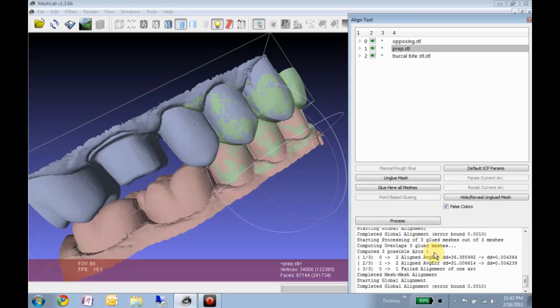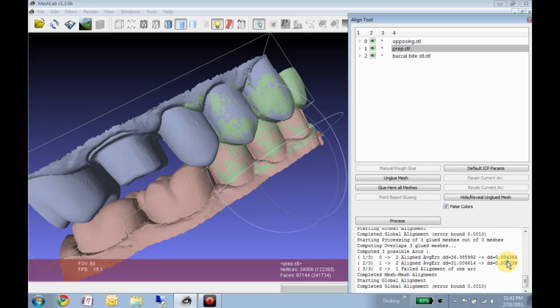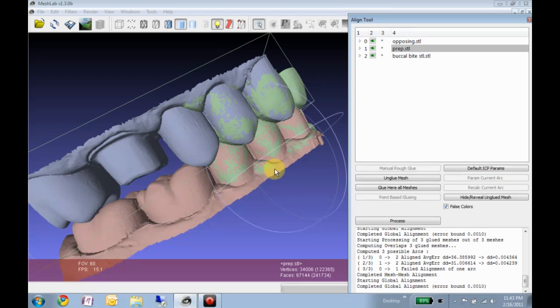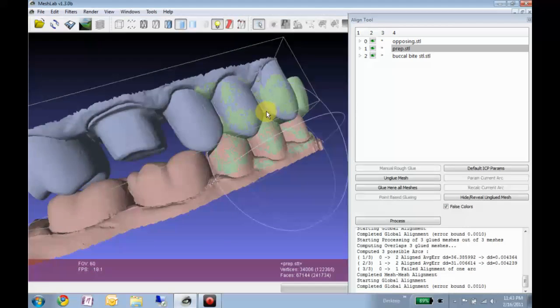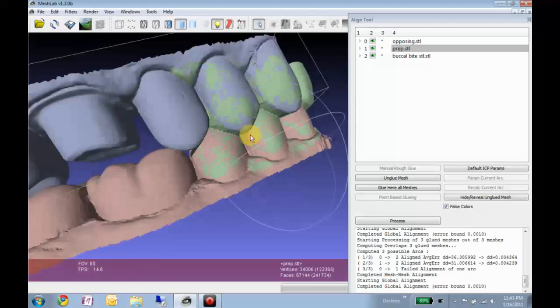All right, so it didn't look like it got a whole lot better, and this kind of tells us our average error is in the 4 micron range, which seems good to me. Almost too good, considering the accuracy.